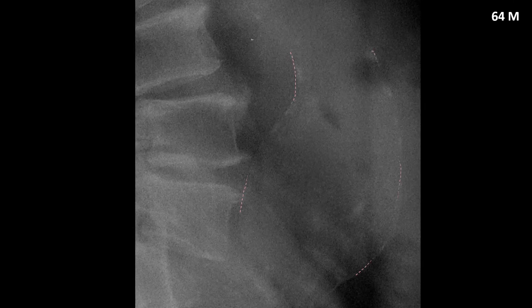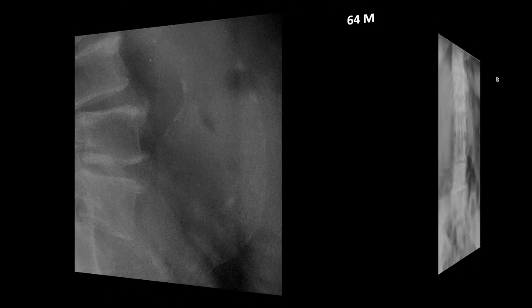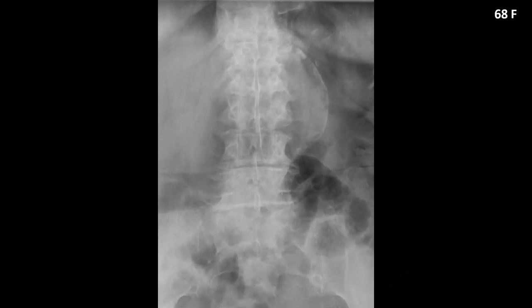In this example, we have a 64-year-old male who presented with significant low back pain and hypotension. The abdominal aortic aneurysm measures greater than 7 centimeters, so in this case this would be an immediate medical consultation for advanced imaging.